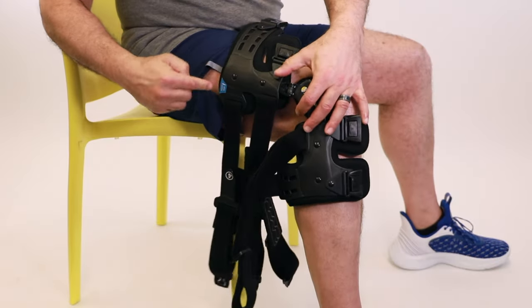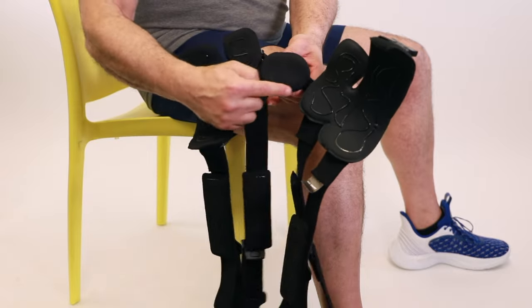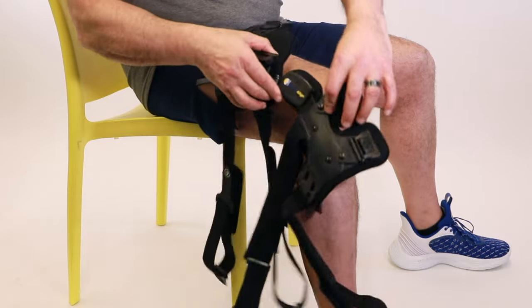Unbuckle all of the straps and check that you have the tab marked 'top' at the top of the thigh. Locate the condyle pad and place it on the outside center of the knee, directly on the skin or on a knee sleeve.